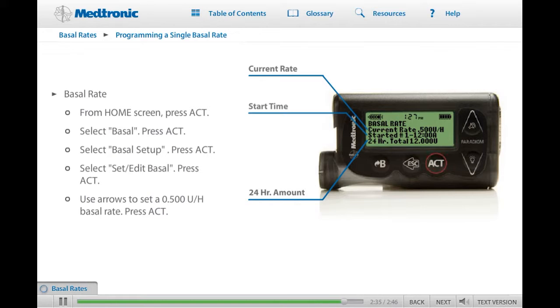If you are practicing using your pump, set a single basal rate of 0.500 units on your pump now. When you are ready, click Next to continue.